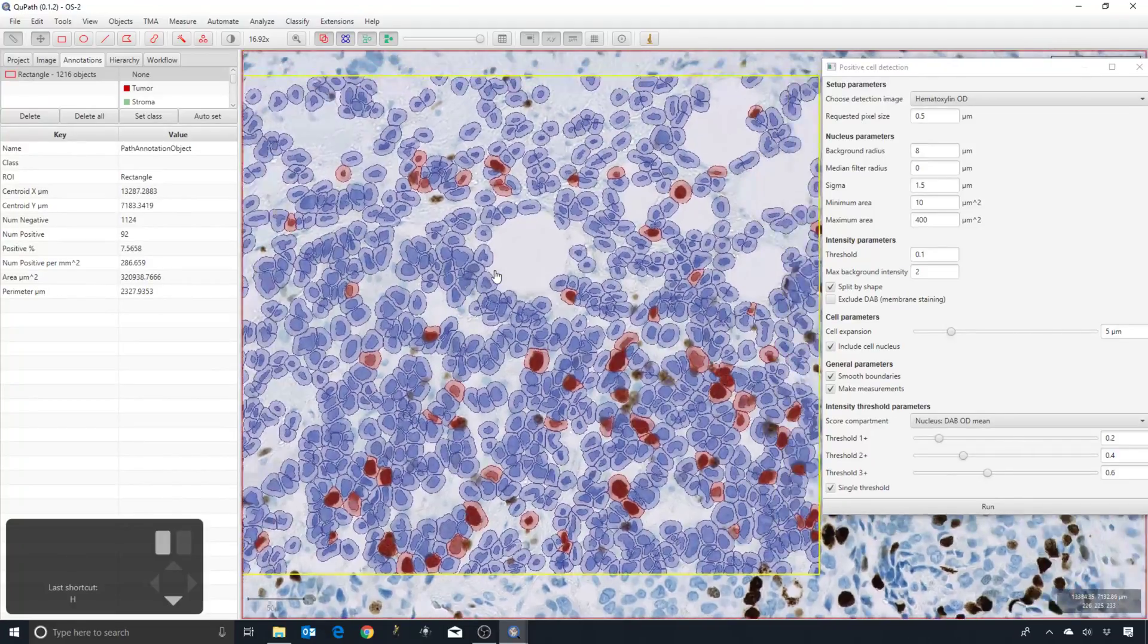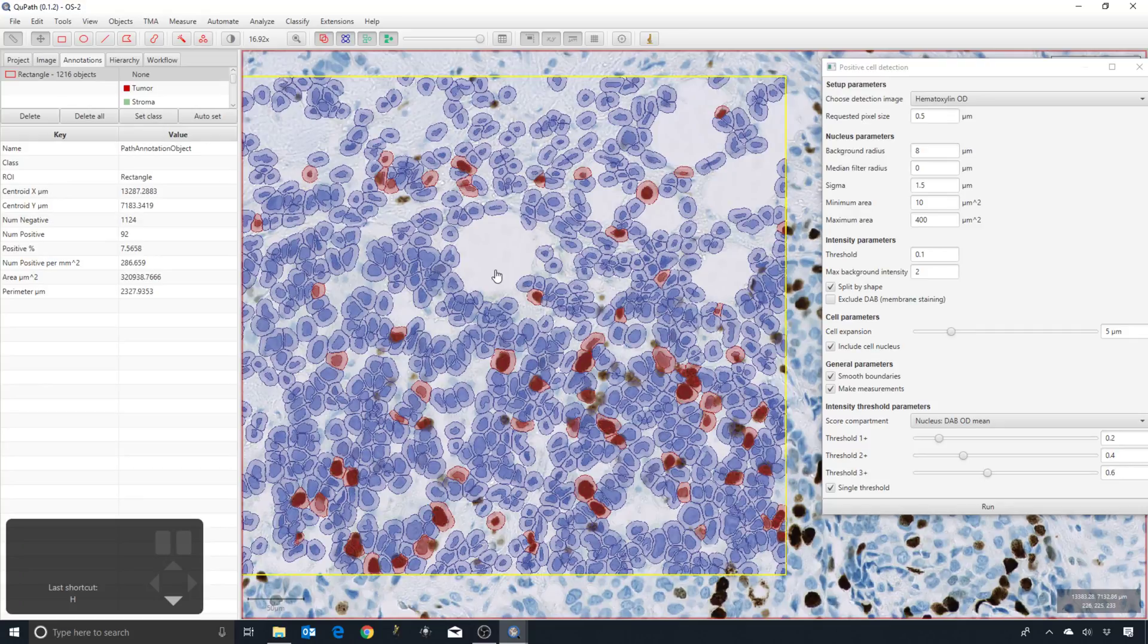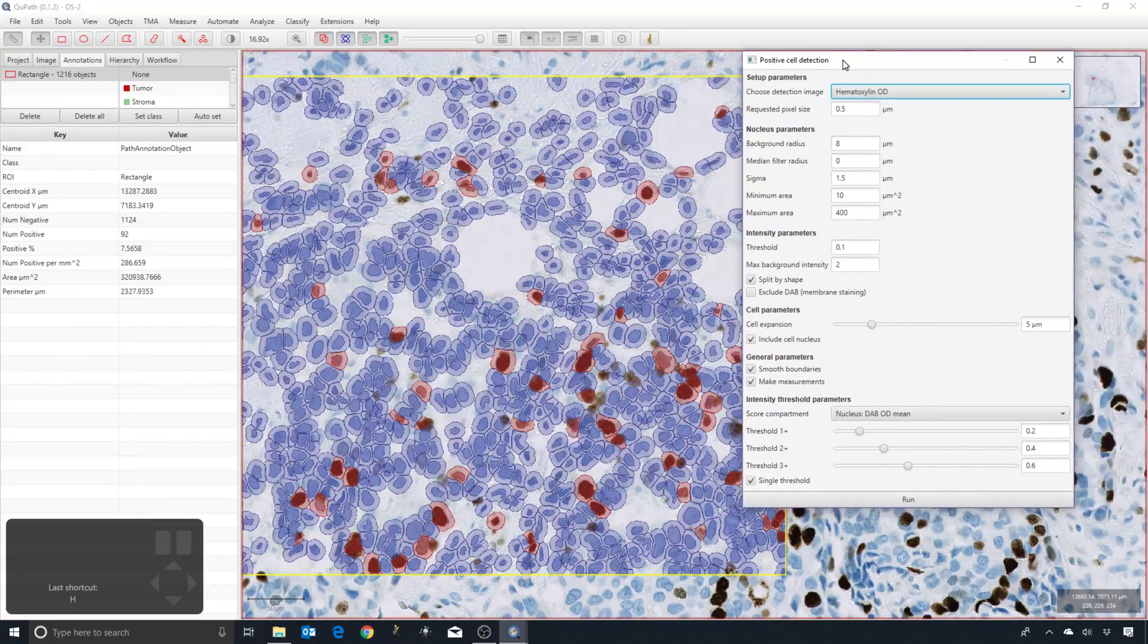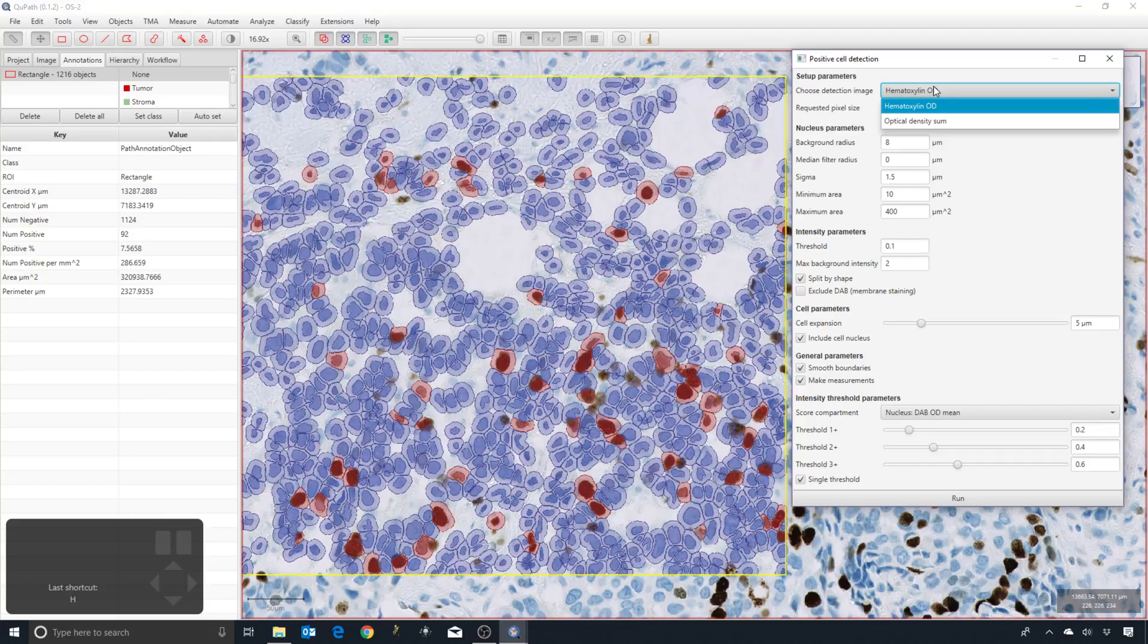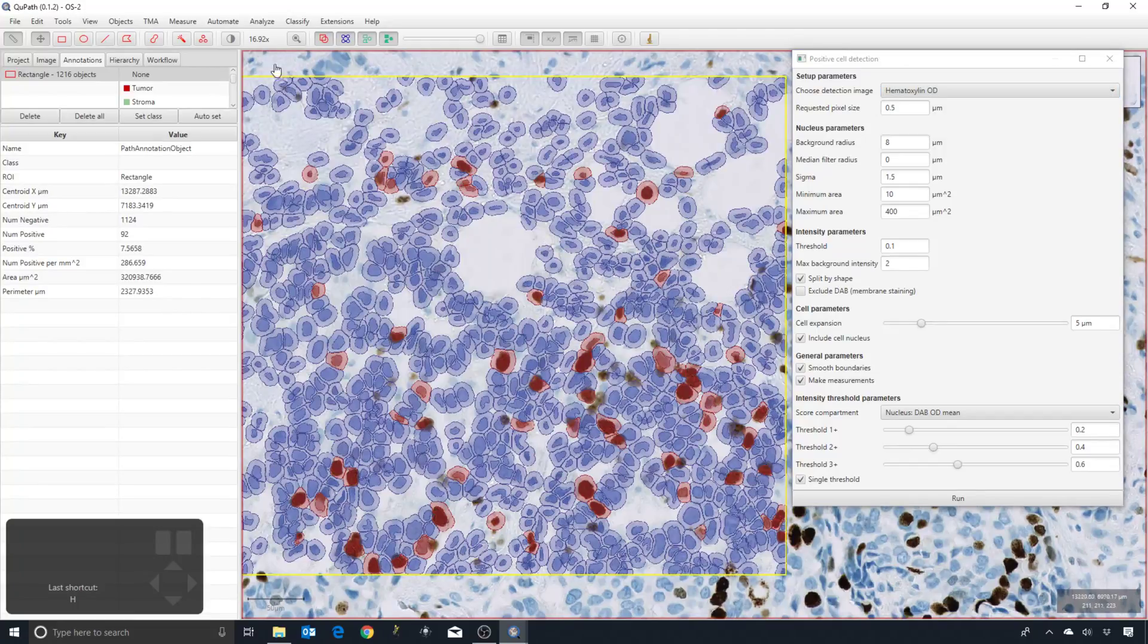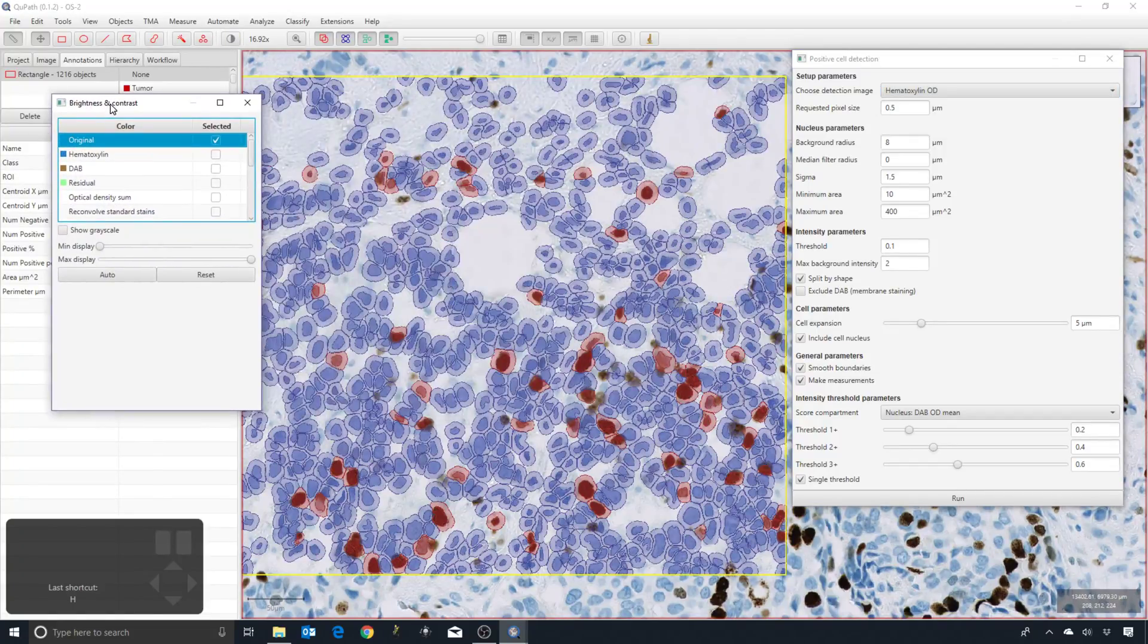Whenever that happens, the first parameter, right here at the start, is the one that I would want to look at first. That is the detection image. We have two choices: the hematoxylin or the optical density sum. These relate to color transforms that we can see under the brightness and contrast tool.